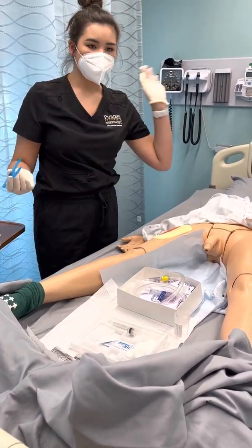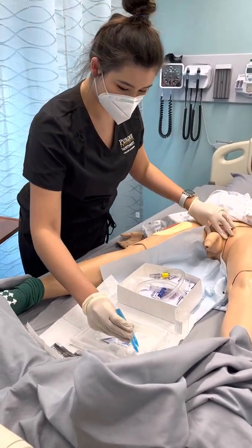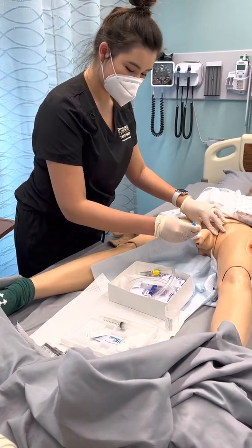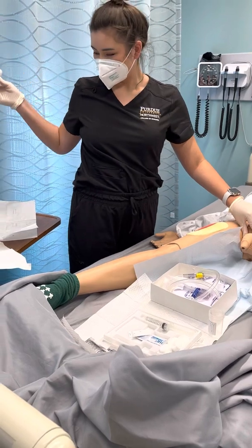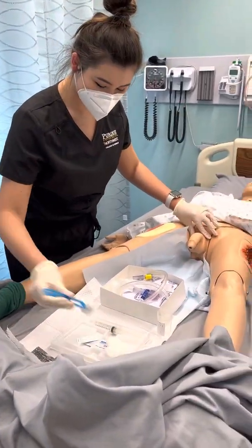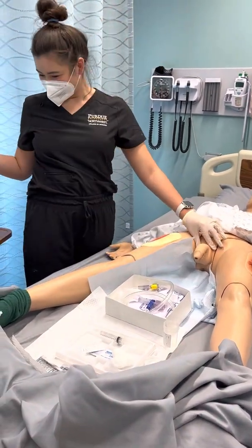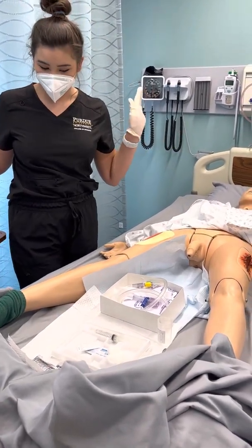We're going to re-clean them again. I'm going to use my non-dominant hand — this one is going to be breaking sterility — so we're just going to clean it the same way we did before. Each cotton ball we use, we just throw it in the garbage. So I'll just put it right here and clean it, and once it's all clean I'll get rid of this too.